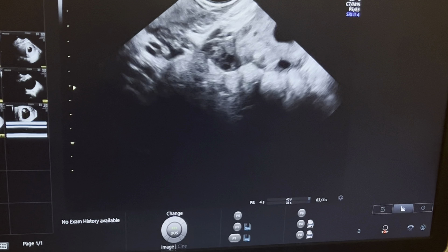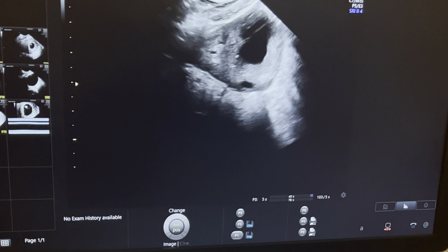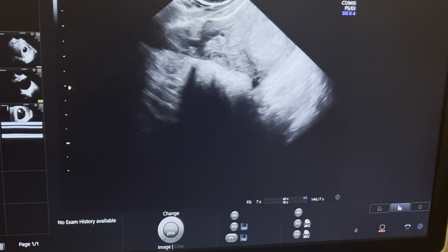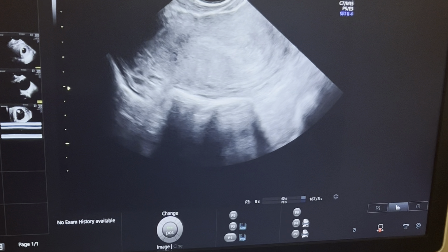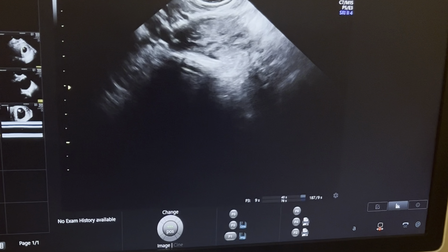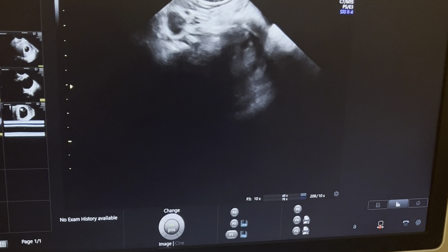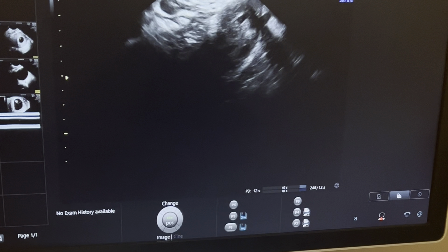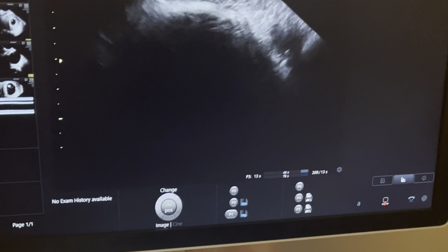Once you take all the measurements and document that there is no FHR, you will have to give the report and sign it. You also need to know that the adnexa has to be imaged — here it is showing it is normal.